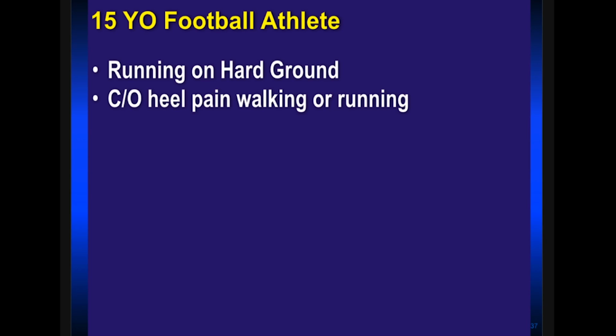15-year-old football athlete doing a lot of running on hard ground. It hadn't rained lately. He complained of heel pain when he walked or ran.